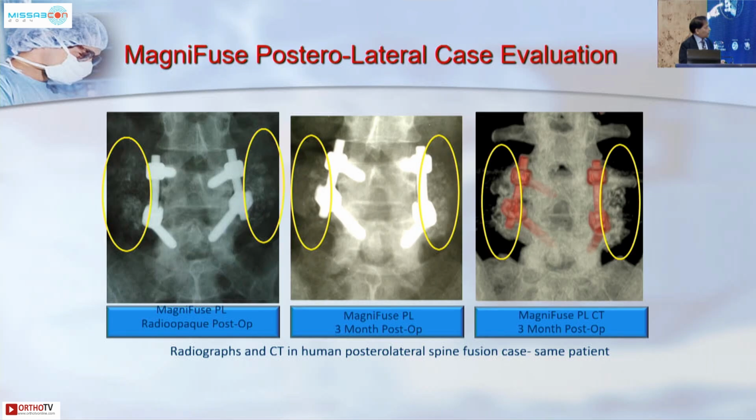This is a trend of what used to be there before. We used to do posterolateral fusion. Nowadays, people do interbody fusion and percutaneous screws, so this has not much to say.